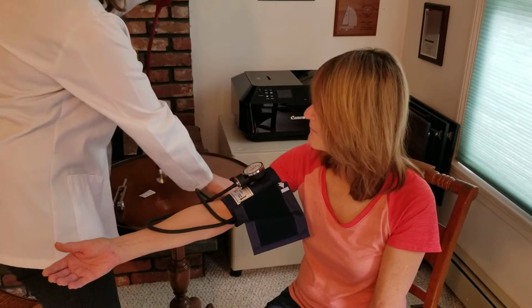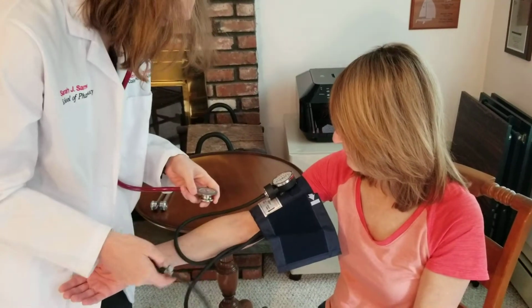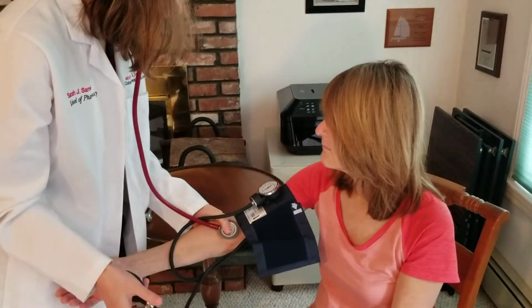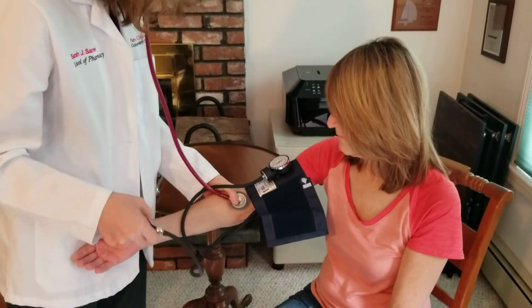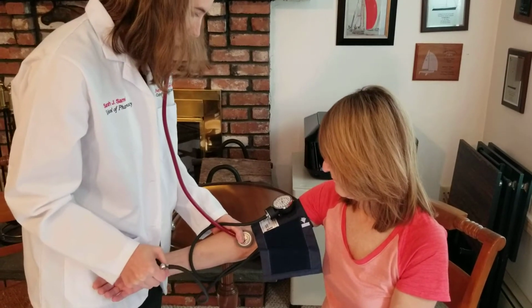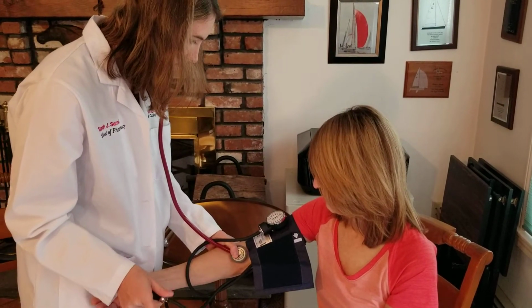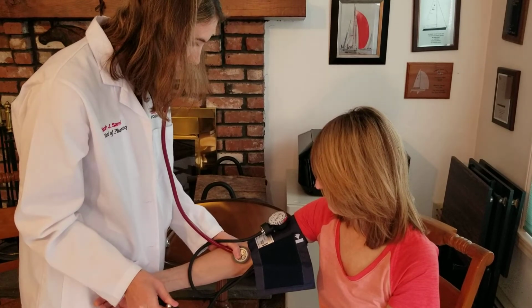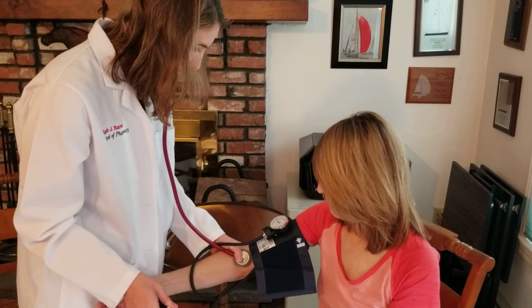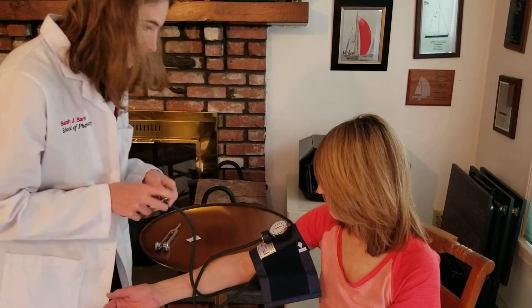So the next thing I'm going to do is I'm going to take the stethoscope and put the bell on your brachial pulse. I'm going to hold on to this. Okay, and then I'm going to make sure that the valve is closed here, and I'm going to pump up the bladder so that it's about 20 to 30 millimeters of mercury above where you had told me your normal blood pressure is. And then I'm going to release it about 2 to 4 millimeters of mercury per second. And listen. Okay. Yep, so that was about 120/65.